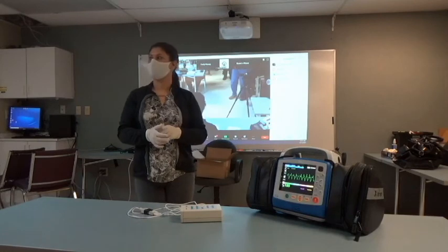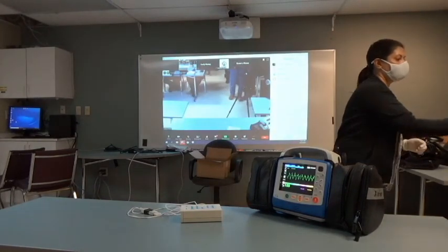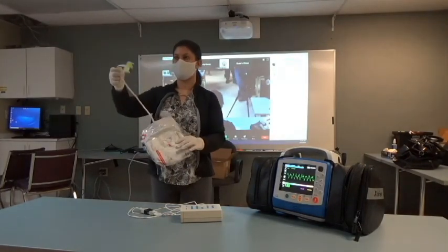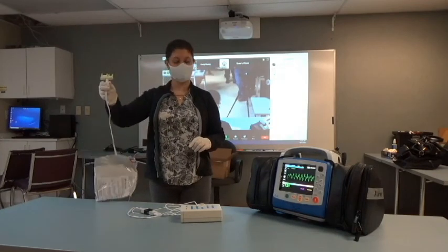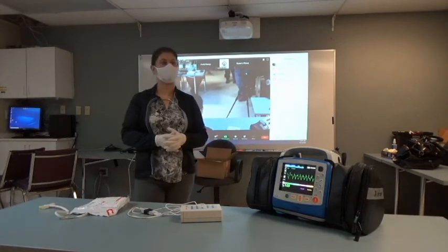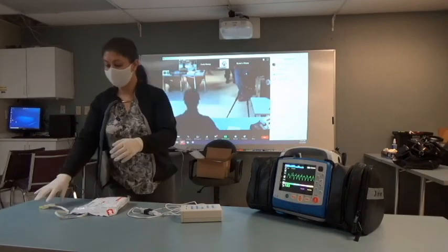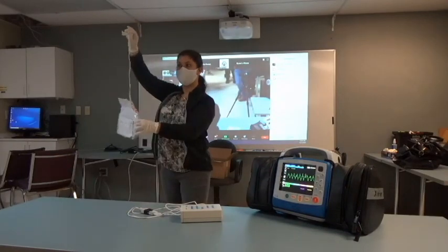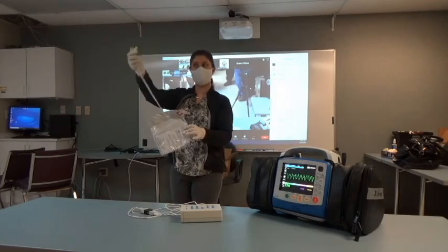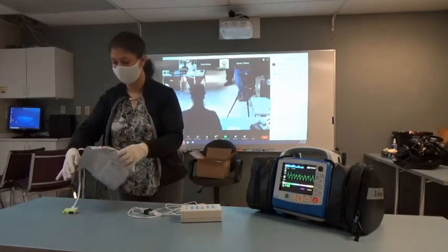Are we going to be getting all the ones with the puck on them, Greg? Yes. Is that our plan? Yeah, the only variation may be if you run into an AED, like a public access AED or a fire department that doesn't have the CPR feedback, it's a Zoll monitor, it'll still plug into our therapy cable, so you wouldn't necessarily have to switch those pads out, but you wouldn't get CPR feedback in that situation. So you'll notice on this set of pads that this is sealed, it has the pigtail, so it's one less thing for you guys to have to worry about. You can actually pre-connect inside of your device if you'd like to, so it's just something to think about.